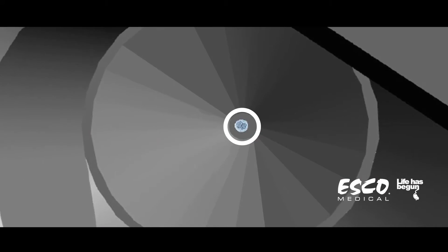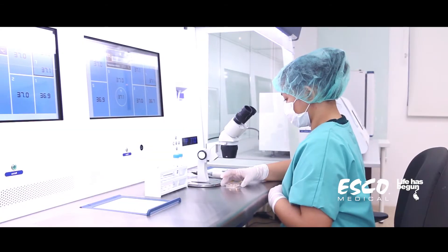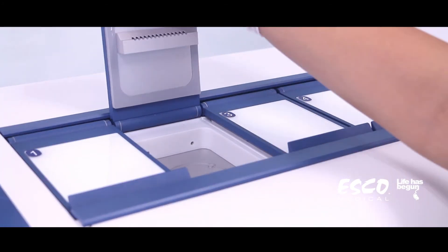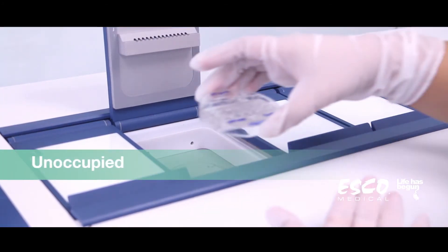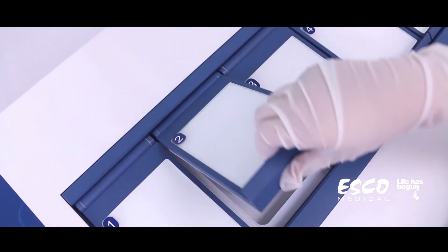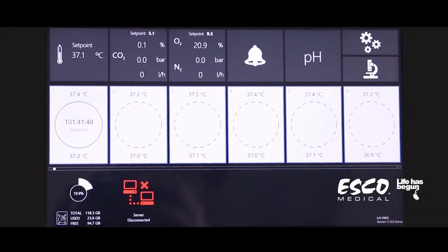Place the embryo at the center of the well to give better videos. Once done, carefully put the embryo loaded culture coin inside an unoccupied MIRI TL chamber. Be sure to keep the culture coin level when moving and inserting it into the MIRI TL.